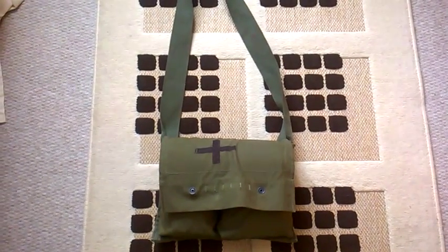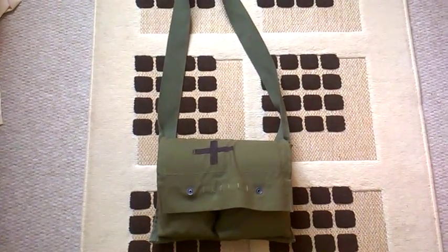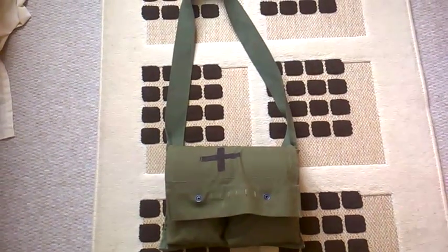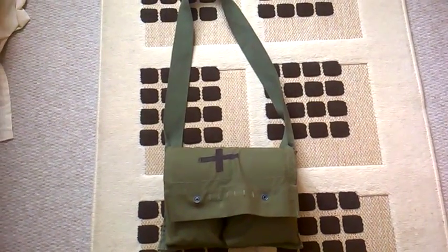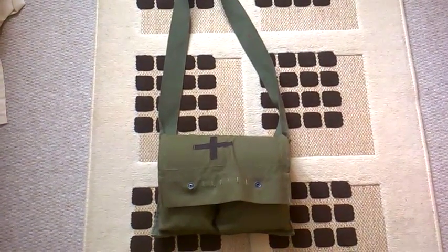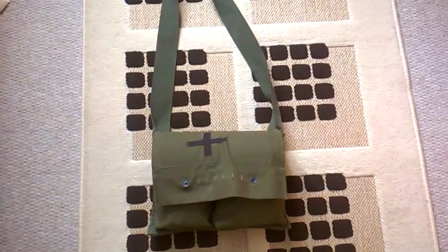Hey there folks, this is the Uniform Guy again here with another video review, this time of something a little unusual. It is current kit, but it is however not issue. This is a medic's satchel from a Team Medic in the Royal Logistics Corps.